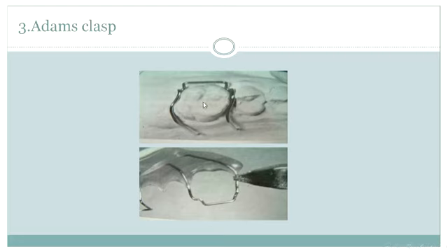Sometimes it is used in the posterior teeth and sometimes we can use it in the anterior teeth, but we must take into consideration the adjustment of the arrow here. The U shape must not be forced more than necessary in the undercut area, in order to avoid extrusion of the tooth or teeth.